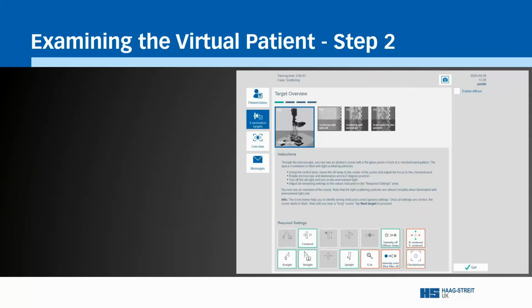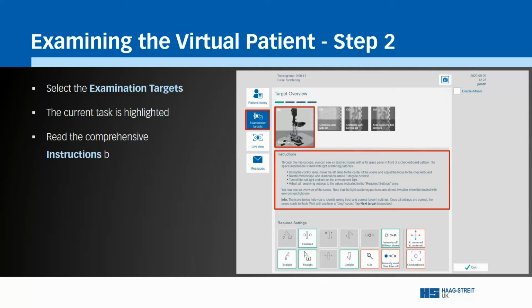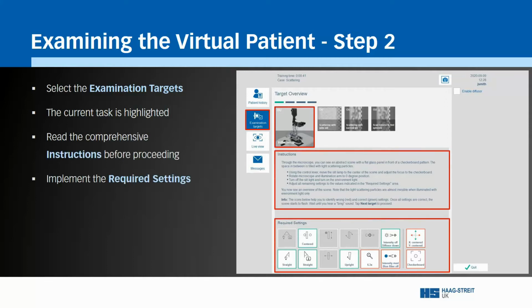When you are ready to begin the task, select the Examination Targets tab. The current task is then highlighted here. It's important that you read the detailed instructions before proceeding. In order to successfully acquire the target and complete the case, learners must implement all the required settings.